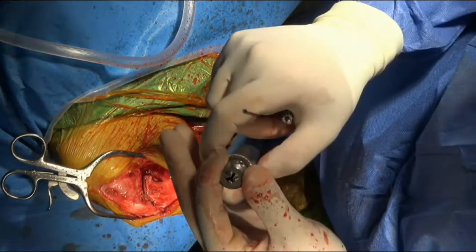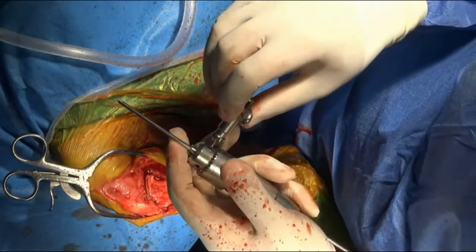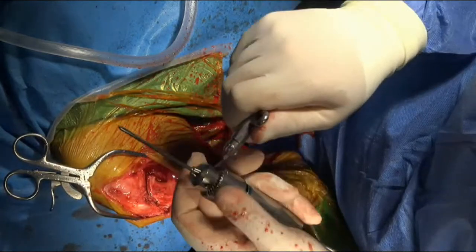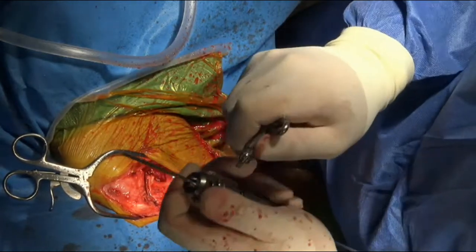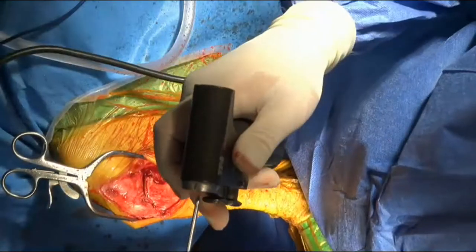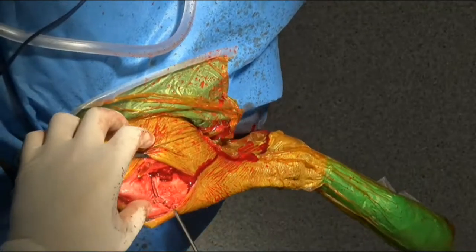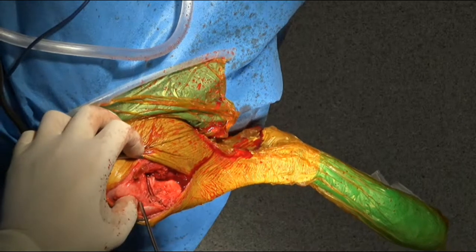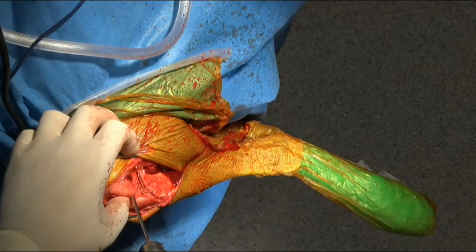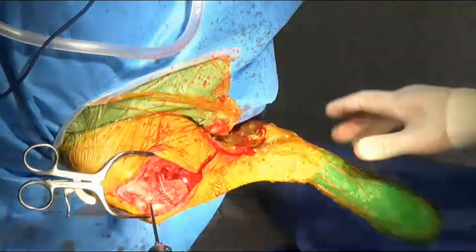So Jess, what was the question on the chat? Why CBLO versus TPLO in this patient? That's a great question. So the reason we're doing that is because the tibial apophysis is still open, and it's a bit hard to explain without the benefit of the x-rays, but if we were to do a TPLO, then that would actually be a risk factor for a tibial crest fracture, I believe, in these guys. And so CBLO is a really nice way to try and get around that problem in these young dogs. And it's probably the only real time I'd do a CBLO over a TPLO is in this exact situation. So it's a large breed dog, and yeah, we're concerned about the risk of a fracture there.